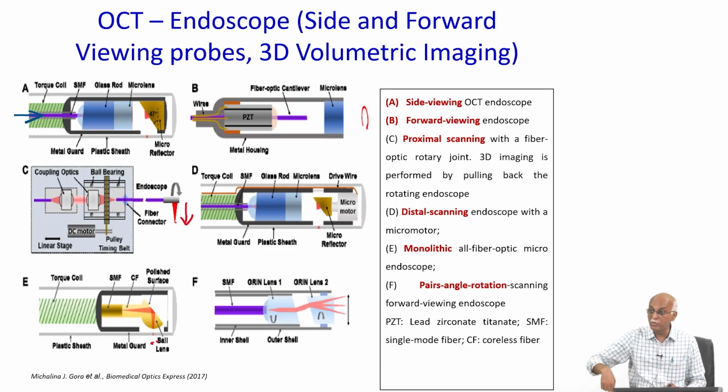It cannot illuminate the object as it is; it has to illuminate the object in a peripheral way. So, we need some configurations. These configurations look very simple, but they are certainly challenging in terms of the device.